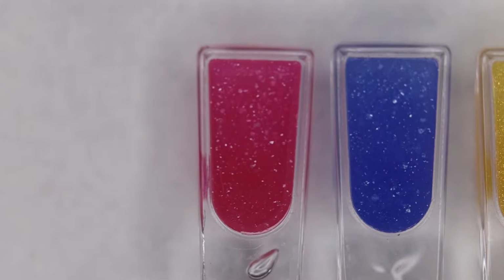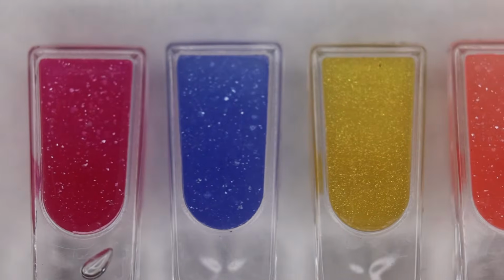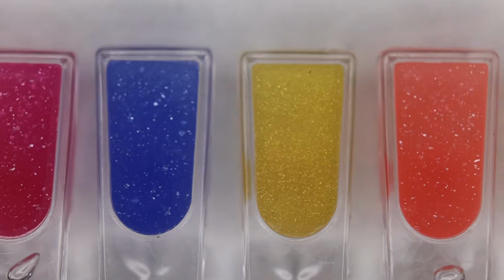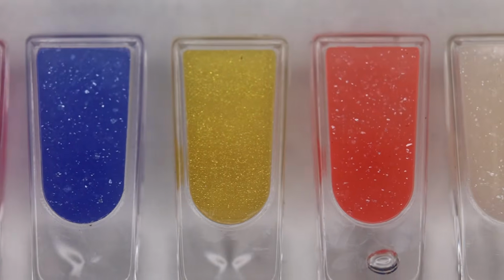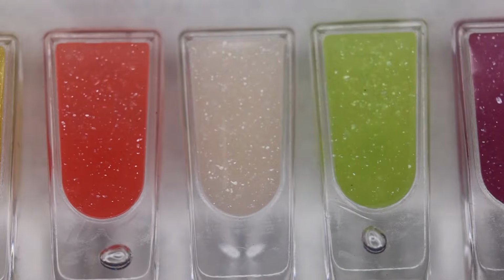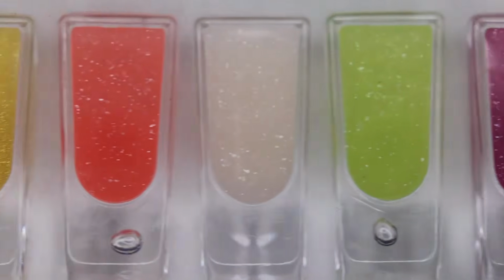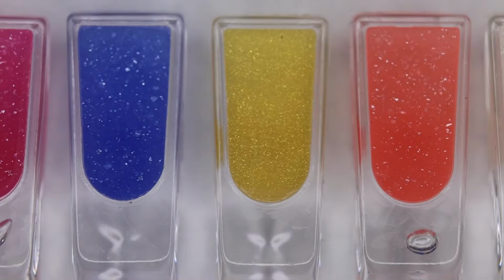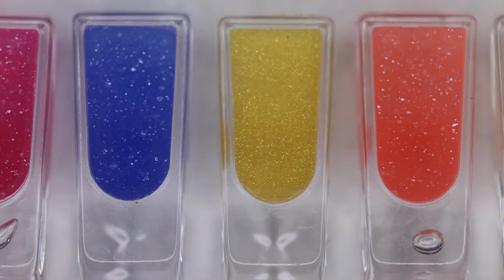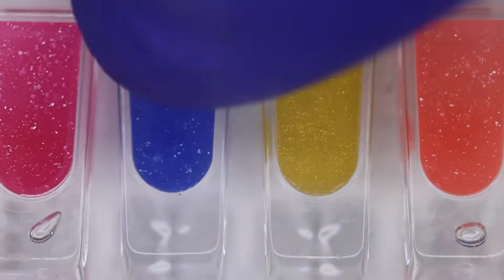We have the pink color, blue color, the golden color, the orange color, the silver, the green, the berry color. Any of the colors you can choose. Otherwise, to just move fast, let us choose the blue color.